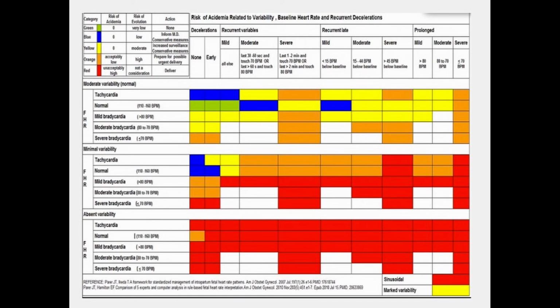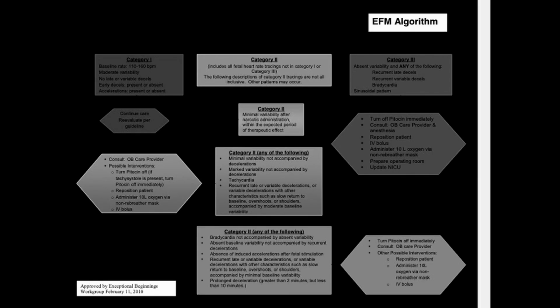When we get into absent variability, there is simply all of this. Everything is associated with really poor fetal outcomes, acidemia, bad gases, and hypoxic ischemic encephalopathy. Okay, even when we have a normal everything else about the heart rate, it's in the normal range. So this color scheme really points to why absent variability is so problematic. It really correlates the best with acidosis in the fetal unit.